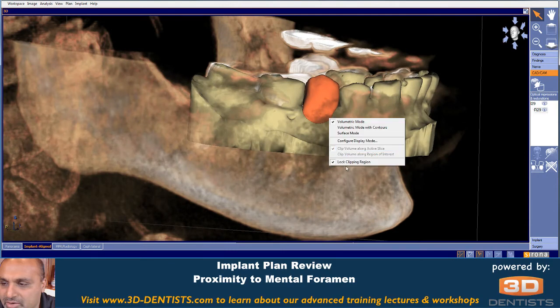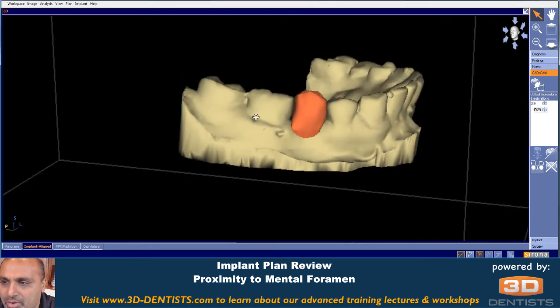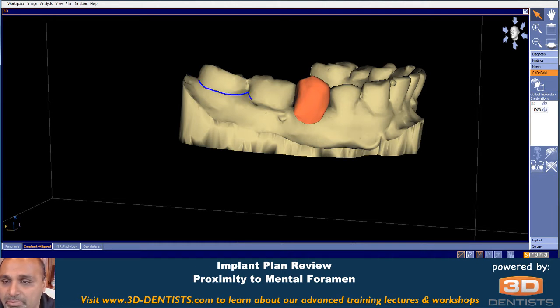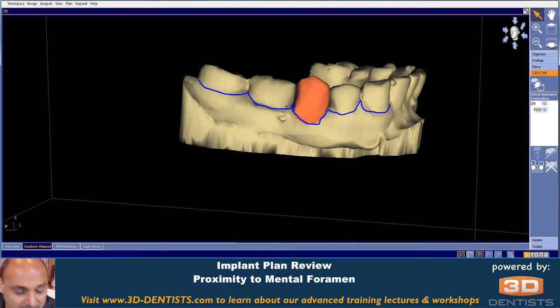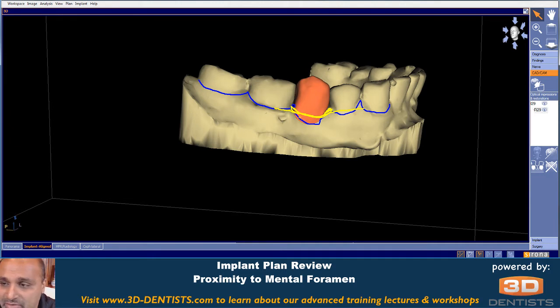The other thing I would like to do in this particular case is give you some pointers about drawing our CEREC data a little bit better. I believe that the better our CEREC data is, the more accurate our implant plan will be, because after all we're doing prosthetically driven implant planning. One thing I can see is it's unlikely that our margin would go that low, so I would draw my margin more along that level here instead of all of this excess down in this area.